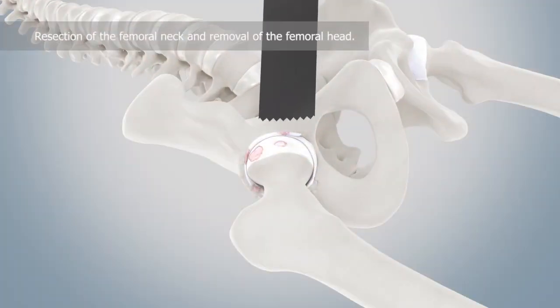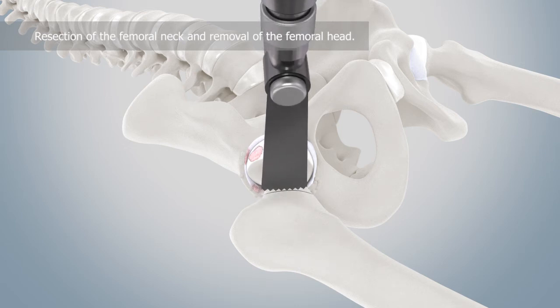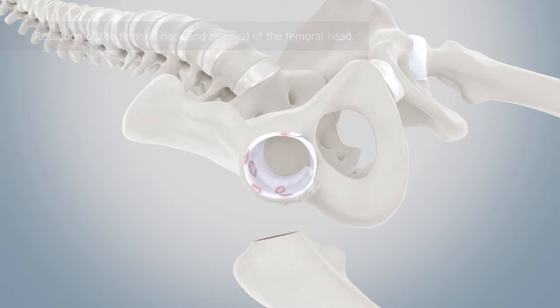After preparation of the access route, the osteotomy of the femoral neck is performed at the planned resection line using an oscillating saw. The femoral head is removed from the acetabulum. This is followed by preparation and exposure of the acetabular rim, e.g. by removal of capsule and labrum remnants.